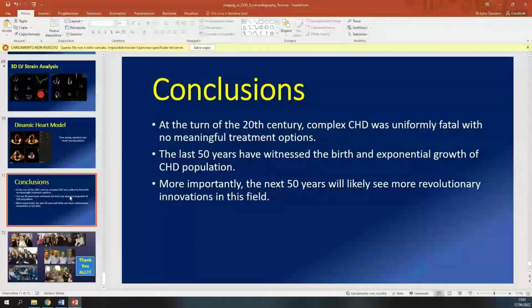And I think it's more important to have longitudinal numbers, which again need to be reproducible, on each individual patient.